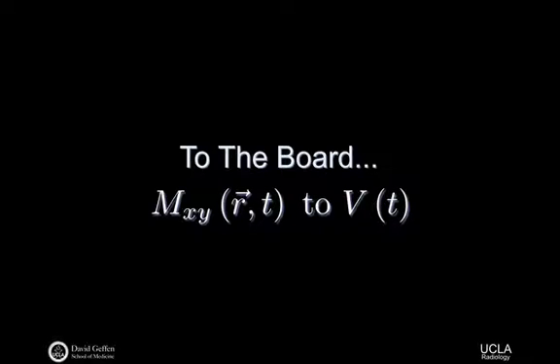So what we end up with in that case is we still have the integral over the object. And now we just have two dot product, or two residual terms. We have the B field for the X component as a function of space times, you know, we wrote it out, but something like dMx, which is a function of space and time, plus our B receiver field in the Y direction, times the partial of dMy.